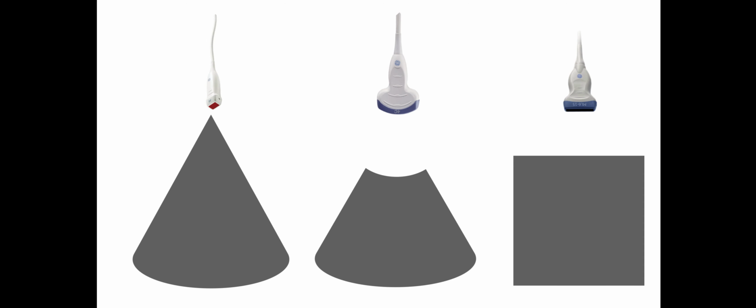Whereas on an abdominal array transducer or a curved array transducer, the footprint's much larger. It means that you get better resolution of the pictures that you see, but this won't fit readily between ribs. Sometimes we'll go across a series of rib spaces though, and we'll use this for lung ultrasound because it probably achieves the best balance of being able to see the ribs and the gap in between. Then we're looking at musculoskeletal applications. We'll use higher frequency transducers and linear array transducers to get the best possible resolution within tissues.